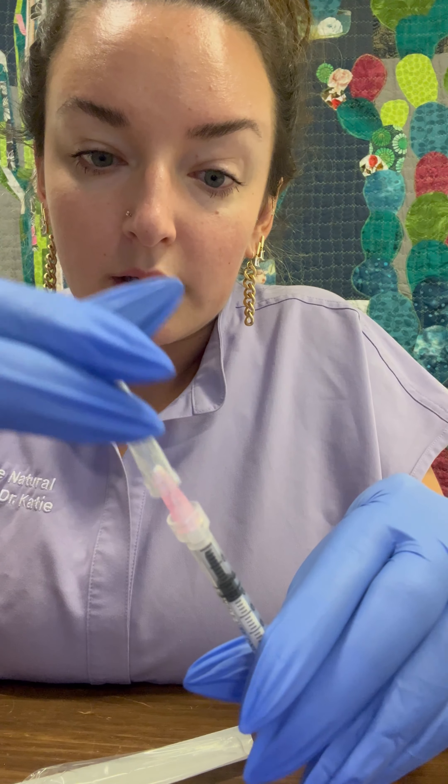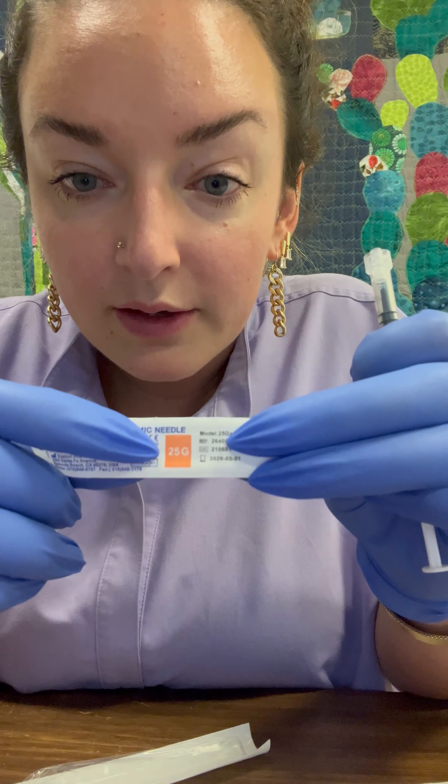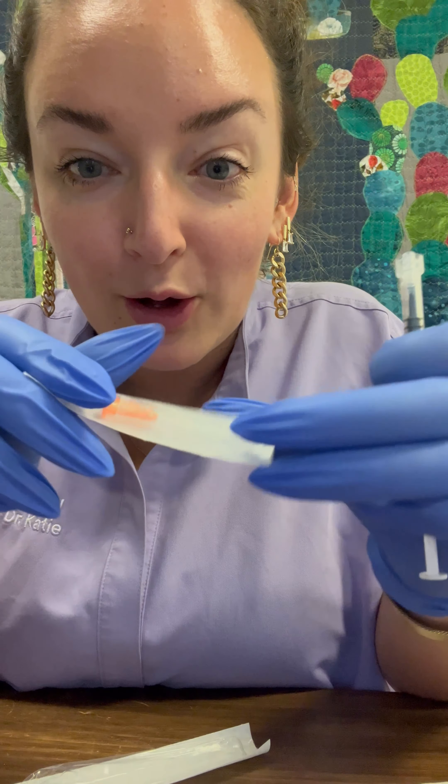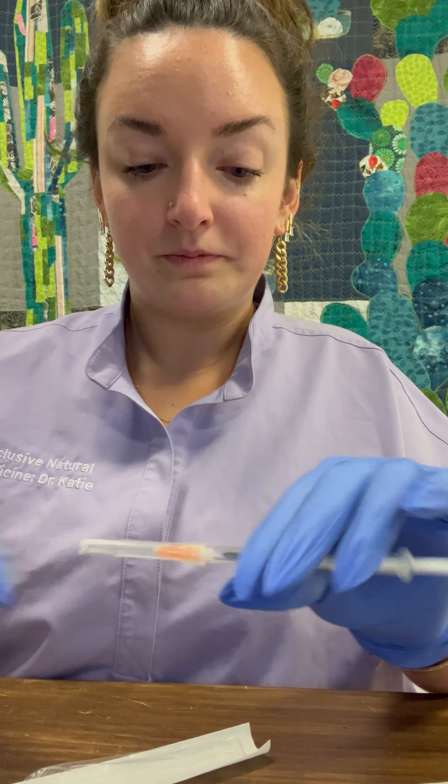You can put the cap back on, twist that off, and then you will twist on the 25 gauge needle which is a lot smaller. Pop that open, twist it on, and then you can do your injection.